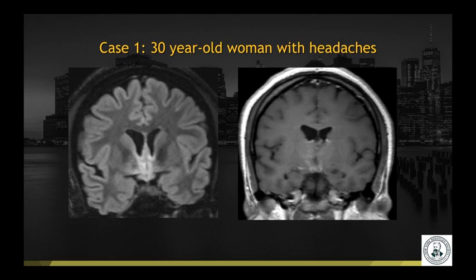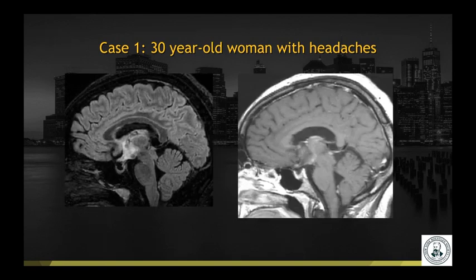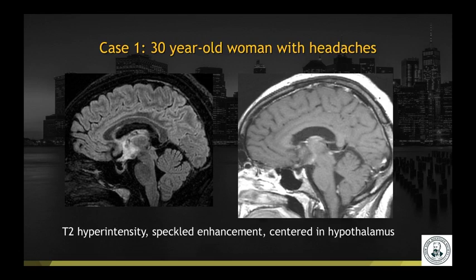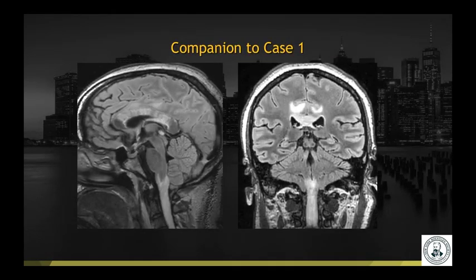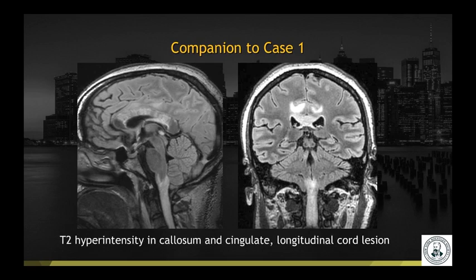Case number one: a 30-year-old woman with headaches. We have a coronal T2 FLAIR as well as coronal T1 post-gadolinium images. This is the same patient with sagittal images shown. Findings include T2 hyperintensity and speckled enhancement centered in the hypothalamus. A companion case in a different patient shows T2 hyperintensity in the corpus callosum and the cingulate gyri bilaterally, as well as a longitudinal cord lesion in the visualized cervical cord.